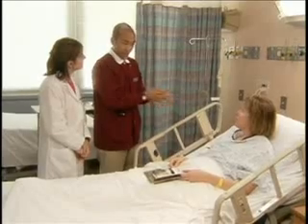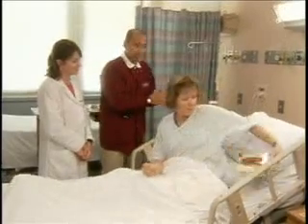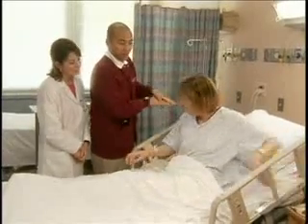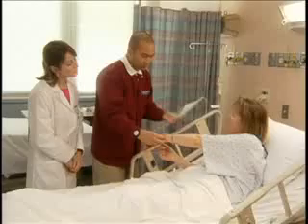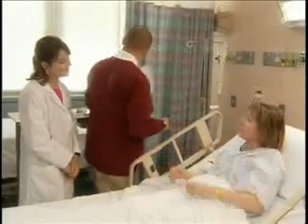Hi. How are you? I'm just here to replace your IV container and tubing for your intravenous infusion. Is that all right? Sure. All right. Let me take a look at your ID band. Can you tell me your name? I can. It's Catherine Hanson. Okay, thank you. How are you feeling? I'm feeling okay. For the most part.